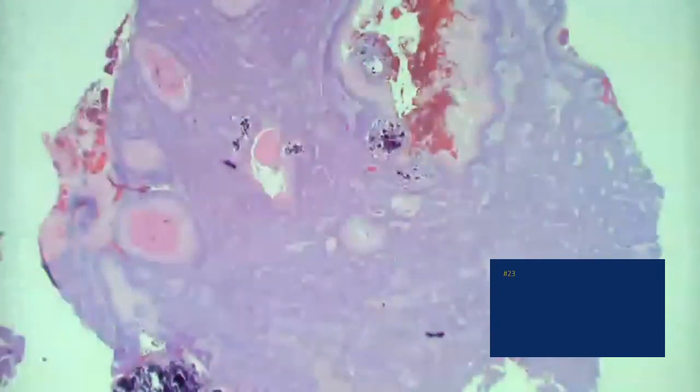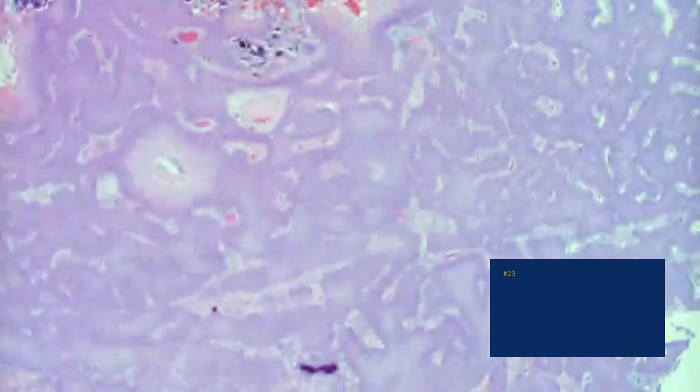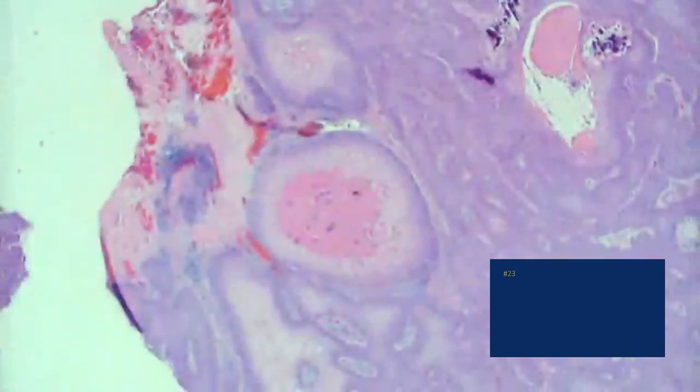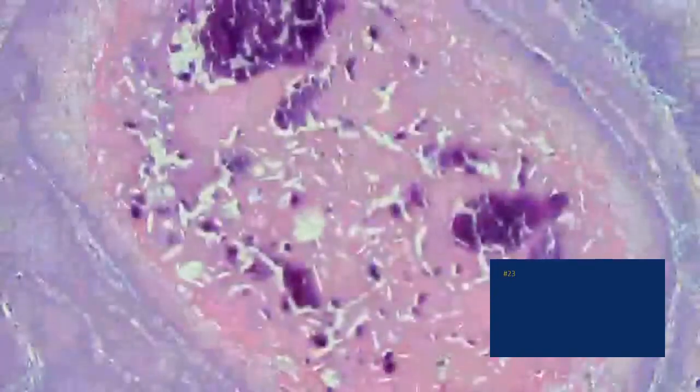What about this? Okay, so it's proliferating. Healing. Yeah, it's very proliferative, right? That's a good term. Does that help you with the diagnosis? I was having issues with this one. I thought it looked like a pilomatricoma, in certain areas. Yeah, but it doesn't have some of the features of pilomatricoma, does it? No shadow cells. No matrical epithelium, really.